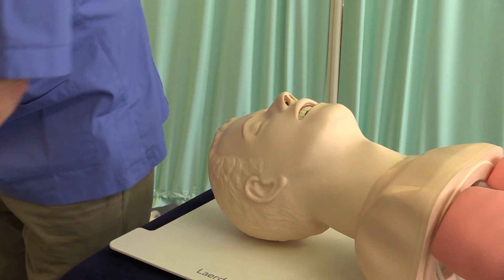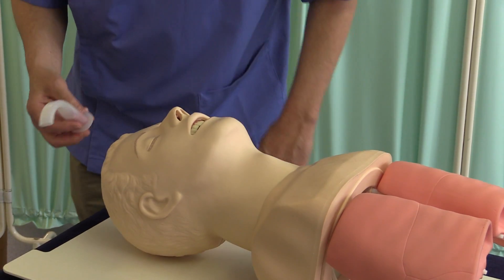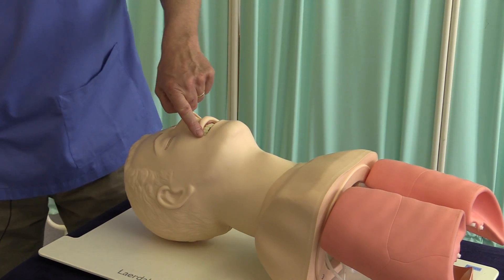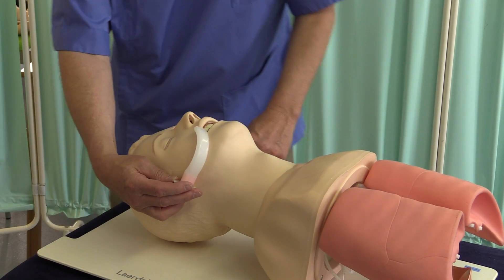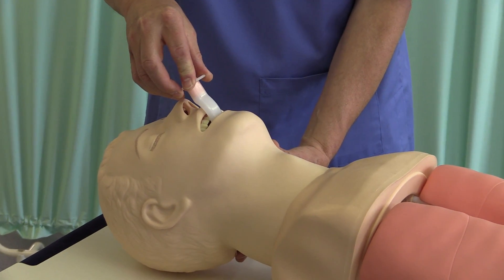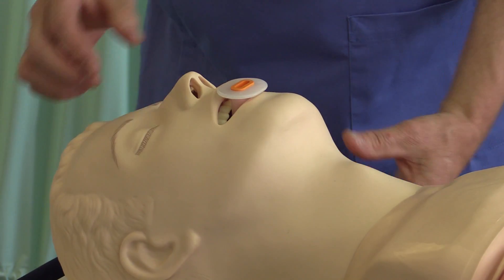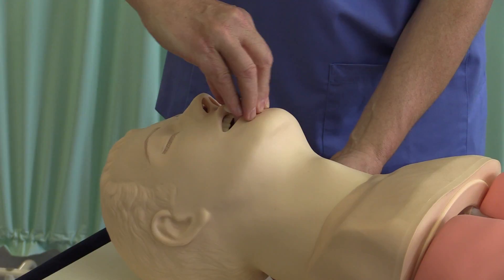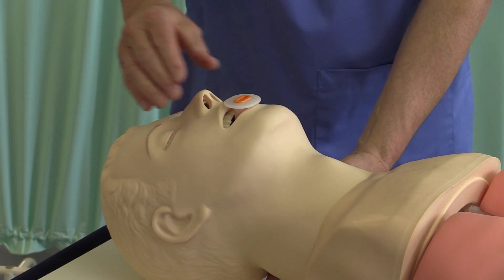To size an oropharyngeal airway, measure from the edge of the patient's ear to the corner of their mouth — so we can find the right size. Then open the patient's mouth; the airway goes in upside down and straight back. When you feel some resistance, twist it round into position, as we saw on the model. With practice it becomes one smooth movement — in upside down, then twisting round — and the airway is in place.